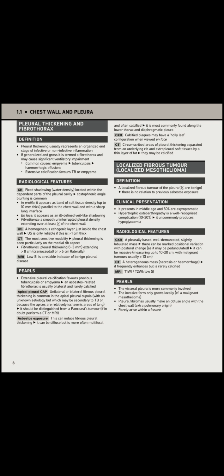And for something really unique, you can see this in images A and B: asbestos-related calcified plaques can sometimes show up with this distinctive holly leaf pattern on a CXR. Holly leaf? Yeah, exactly. Those crisp, kind of scalloped edges. Almost looks like a real holly leaf. It's a real telltale sign of past exposure. Wow, that specificity with the measurements and the holly leaf, that really helps.